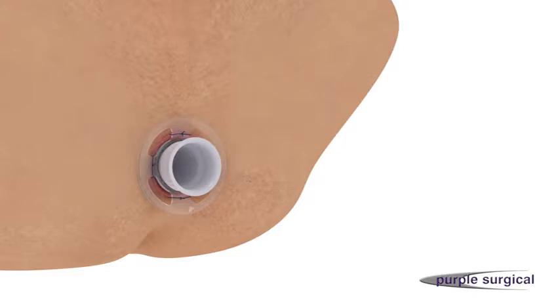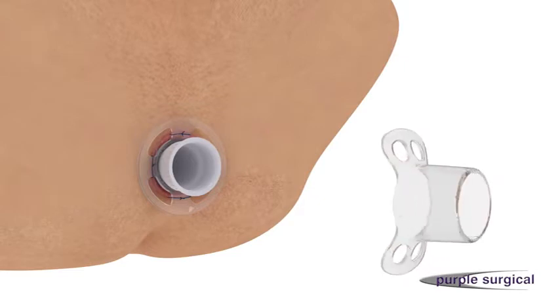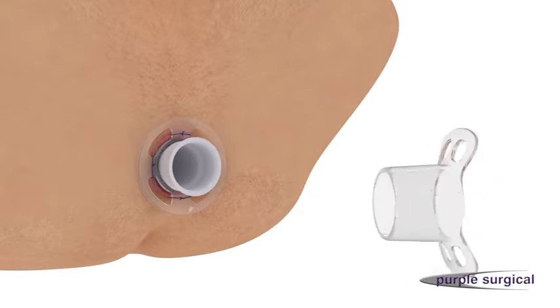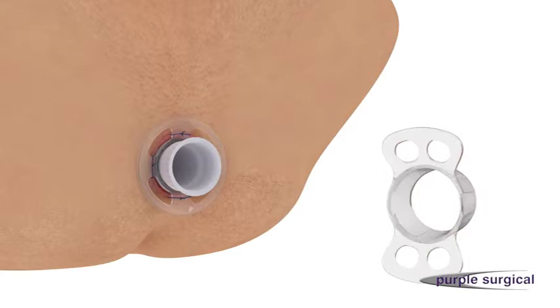Typically, a circular anal dilator is used. However, a butterfly anal dilator is available and has been specifically designed for patients with a narrow pelvis, allowing deeper insertion into the anal canal.